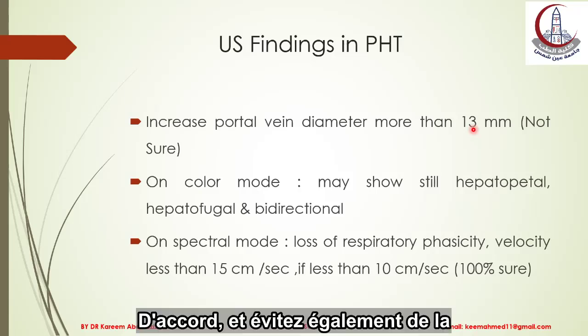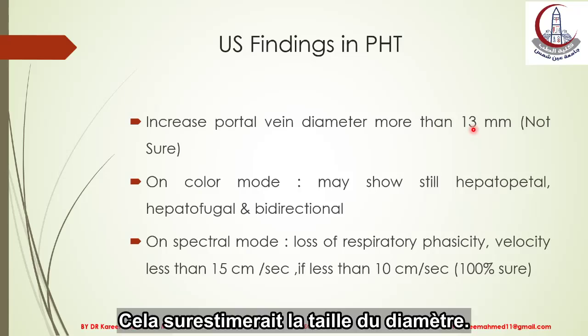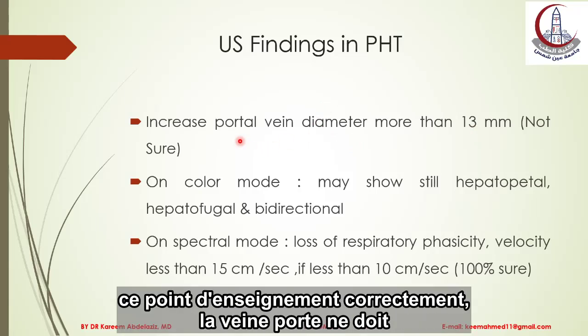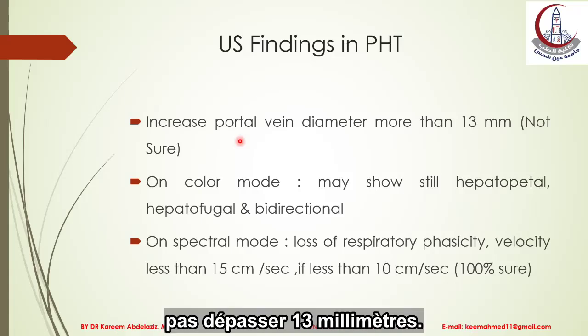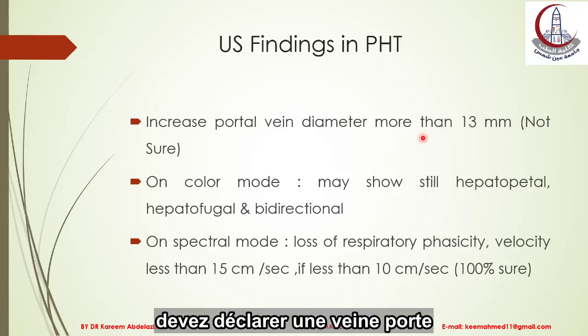Okay, and also avoid measuring it during deep inspiration. This will overestimate the diameter size. Okay, so if you follow this recommendation and teaching point correctly, the portal vein should not exceed 13 millimeter. If it exceeds 13 millimeter, you will report this as dilated portal vein.